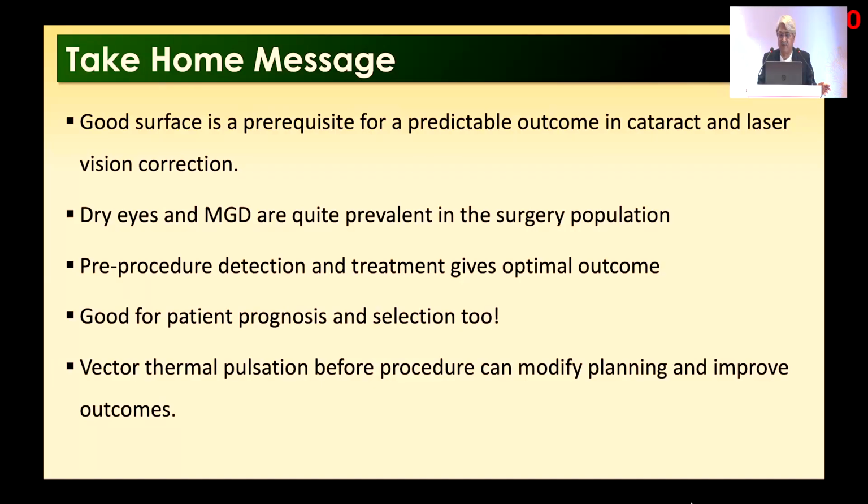So basically it is required for both cataract and refractive surgery pre and post, and also for the IT population, IT workers, the children who are on online platforms. And pre-procedure and post-procedure, you have to follow up this patient.